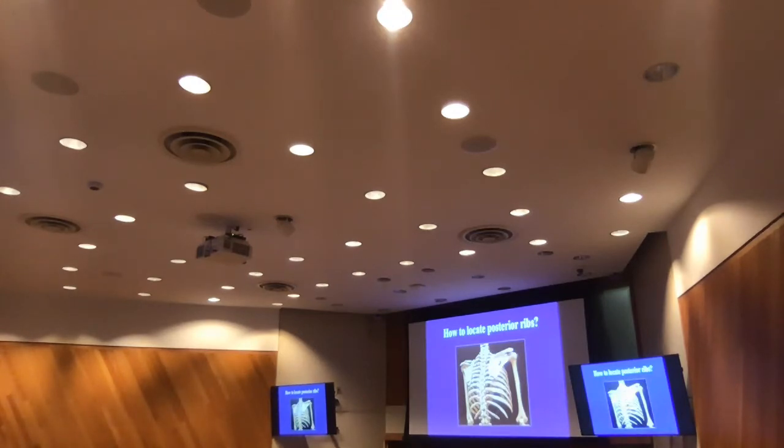So on the body, there is a rib that can be palpated. The 3rd rib, what rib could that be? How many pairs of ribs do we have? Well, the 11th is palpable in most patients. Again, if you go after the class, check with each other or check with the patient, you'll be able to tell. I'm feeling my own right now. The tip of the 11th rib is palpable. There are 2 free ribs that don't connect to the costal margin. The 12th is too short, too deep. So the 11th rib is palpable. If I can find my 11th rib, I can find my 10th rib and 9th rib. Most of the time, we're looking for the 9th rib.